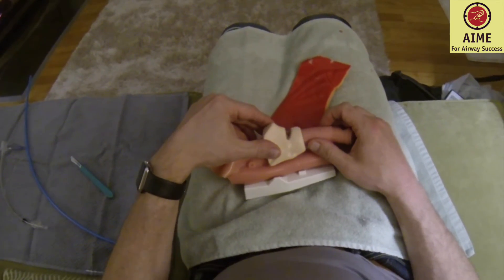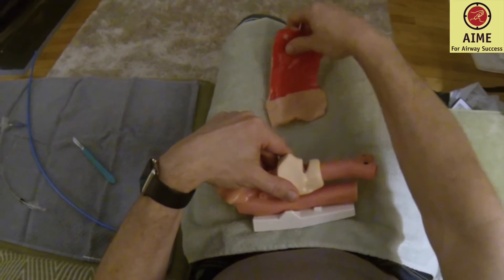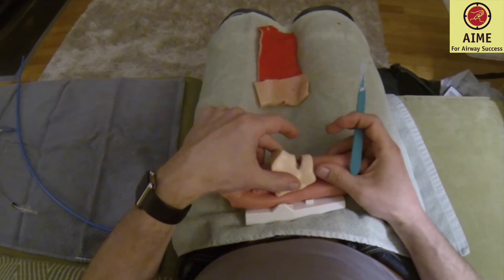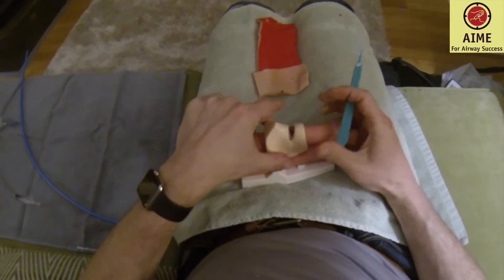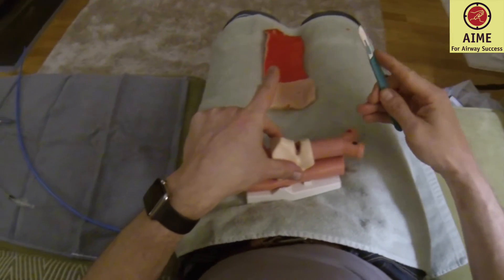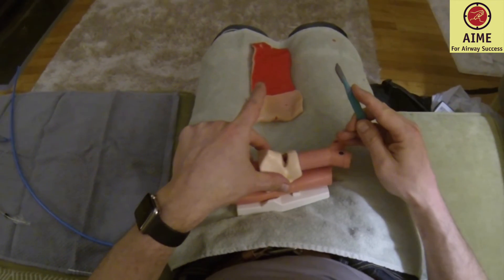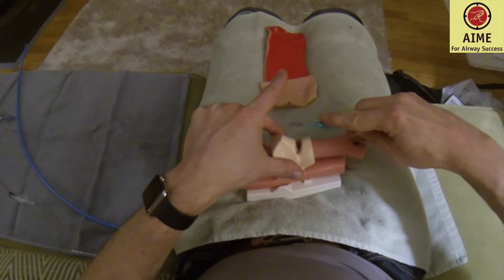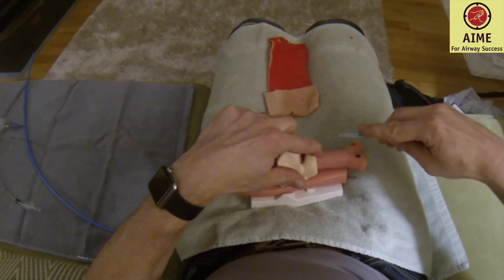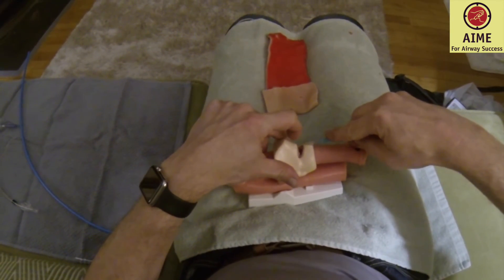I'm going to demonstrate this without the neck skin so you can see things clearly. We stabilize with thumb and middle finger. I'm going to hold a number ten blade — it's key to have a number ten blade, meant for cutting and incising the cricothyroid membrane, not a number eleven or number fifteen. I'm going to cut with the belly of the blade and make a long incision — two swipes really to get down through skin.